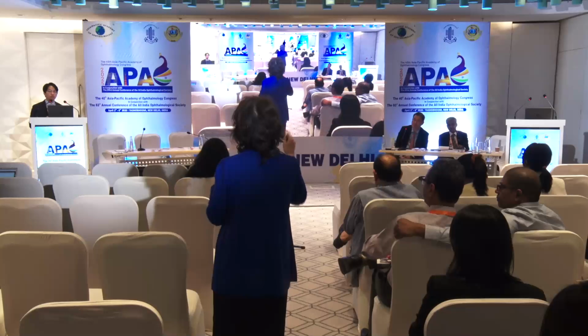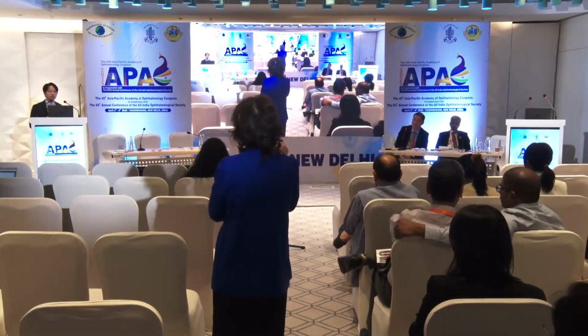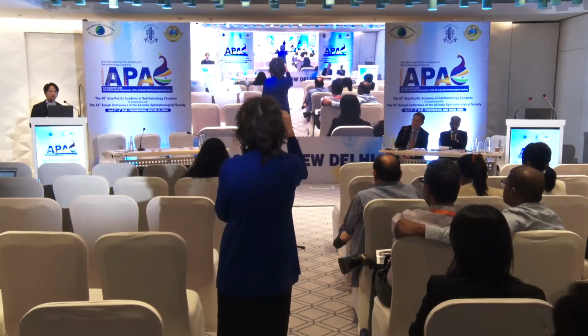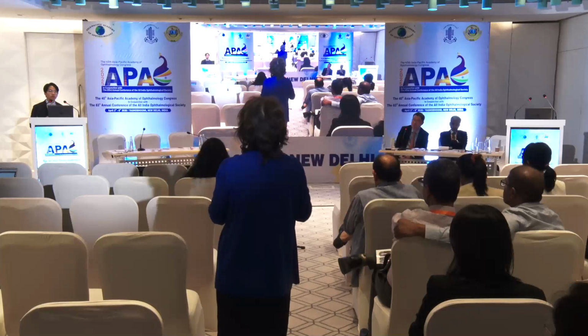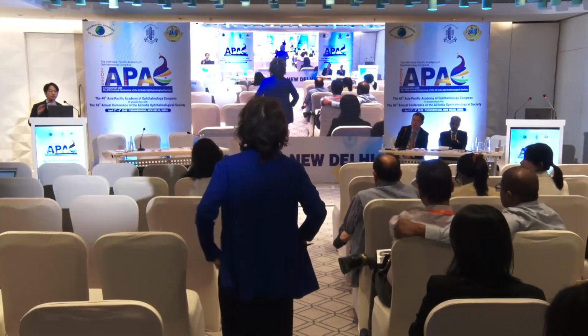I do surgery for this kind of patient with ILM removal. I leave one disc distance or half disc distance of ILM from the vessels. So we need to change the maneuver.